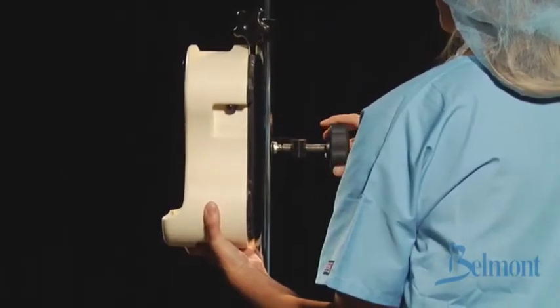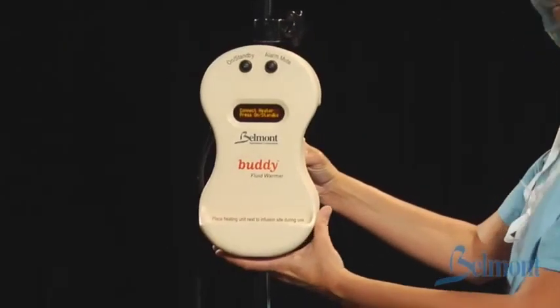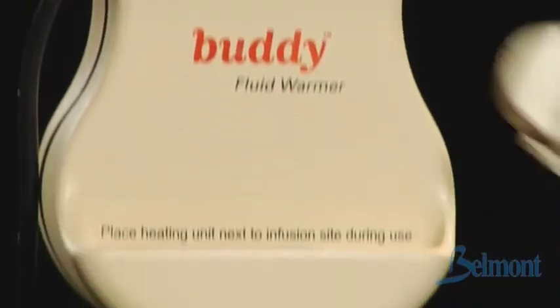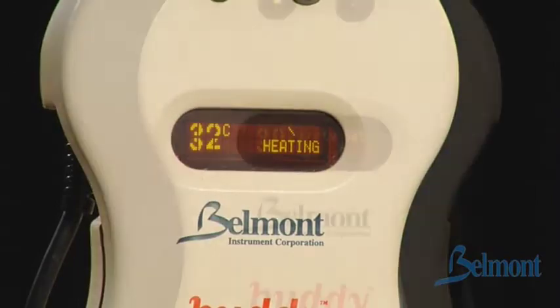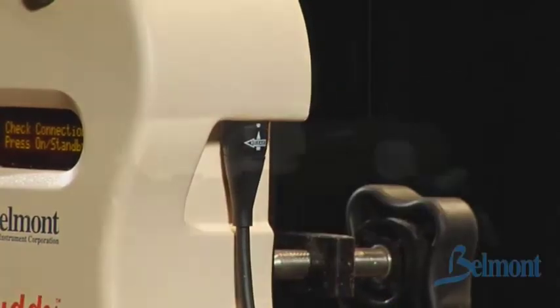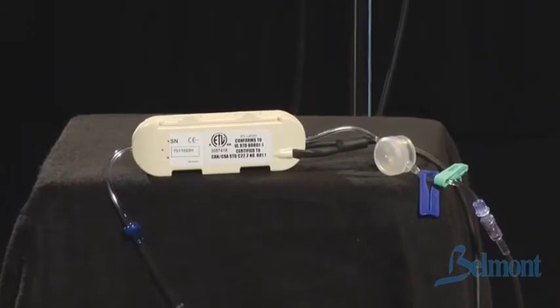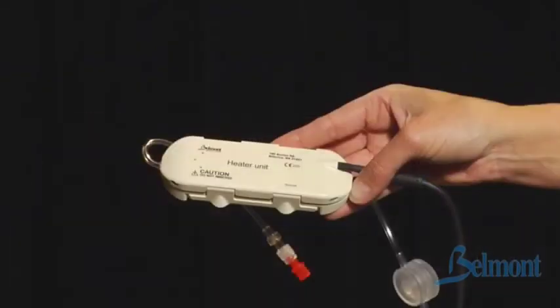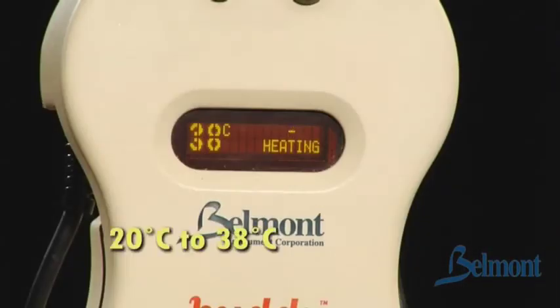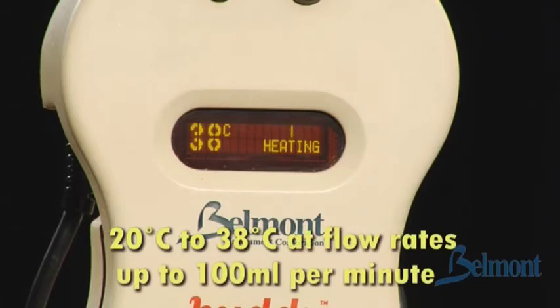Attach the power module to an IV pole using the screw clamp on the back. The power button, mute button, display panel, and heater unit holder are located on the front of the power module. The display panel clearly shows the fluid temperature, alarm, and status messages. Attach the heating unit to the power module by aligning the arrow with a dot and pushing until it snaps into place. The tiny heater unit uses clean, dry heating that is extremely responsive. It has multiple heating and sensing zones to warm fluids from 20 degrees Celsius to 38 degrees Celsius at flow rates up to 100 mLs per minute.